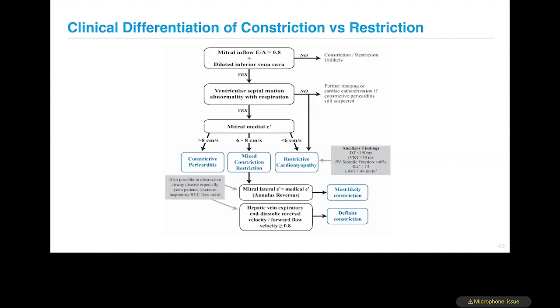The diagnosis of constriction and restriction continues to be extremely challenging and requires multiple variables that need to be added together towards the diagnosis.